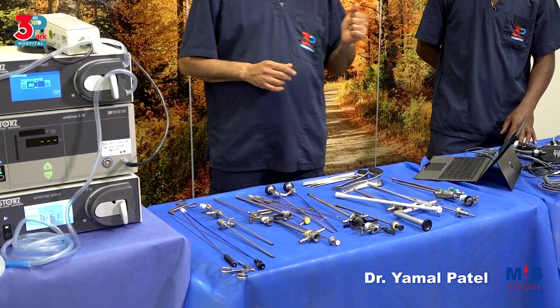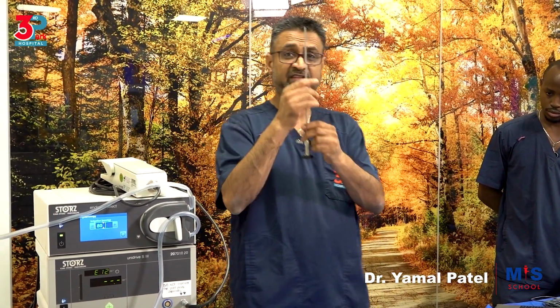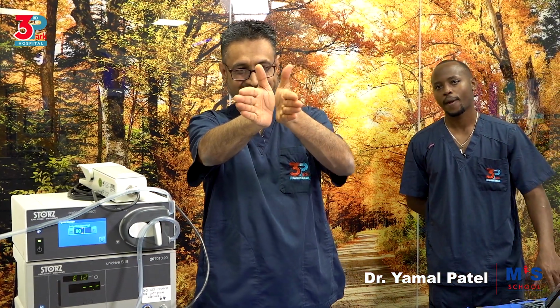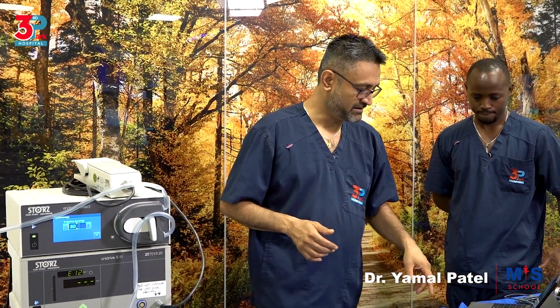But when you're talking about doing resectoscopy, then a 12-degree scope is better, because when you have a 30-degree scope, you're looking completely off your front view and your instrument cannot bend, your instrument will be cutting somewhere different from what you're seeing. So you need a 12-degree so that it's closer to your operative field. So resection, 12-degree. Diagnostic, 30-degree or 0-degree. Operative, cold scissors, 30-degree, or cold instruments, 30-degree.